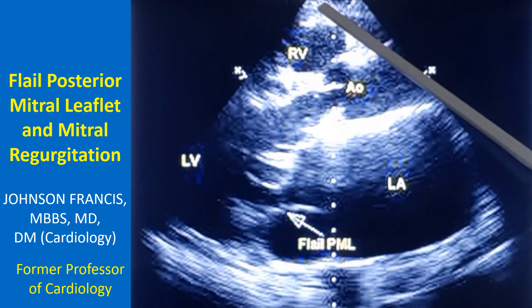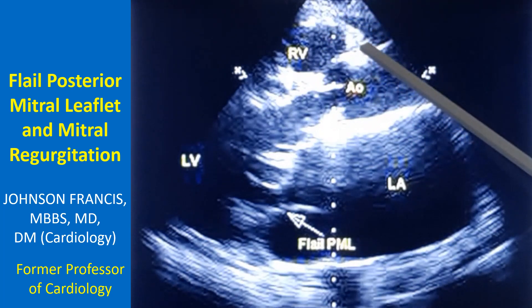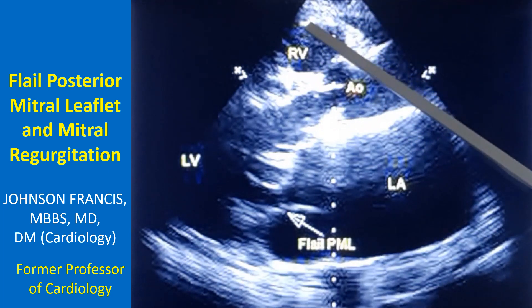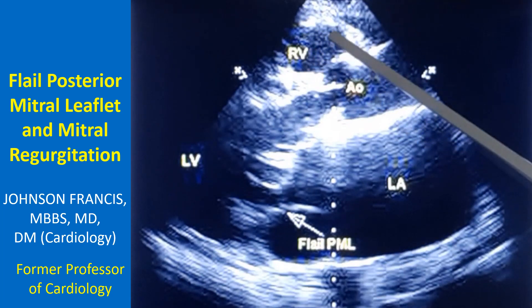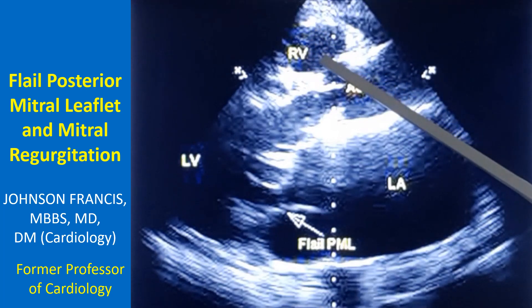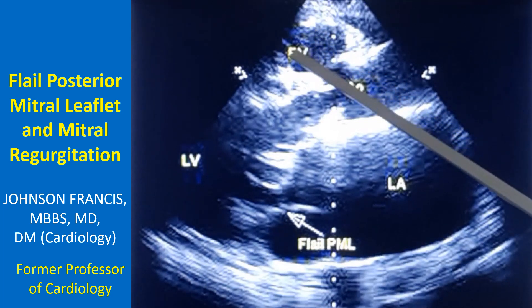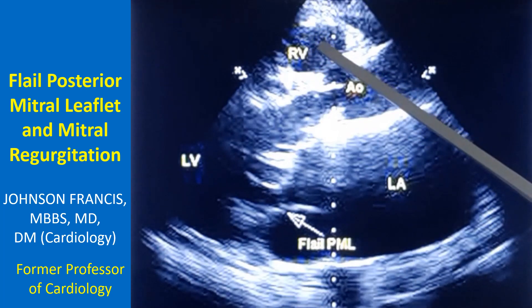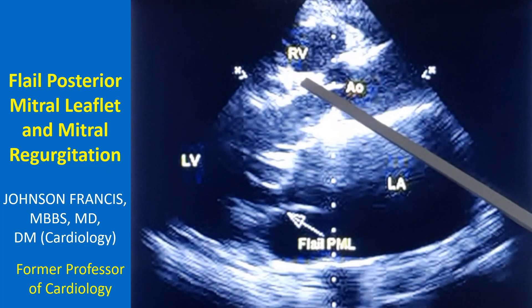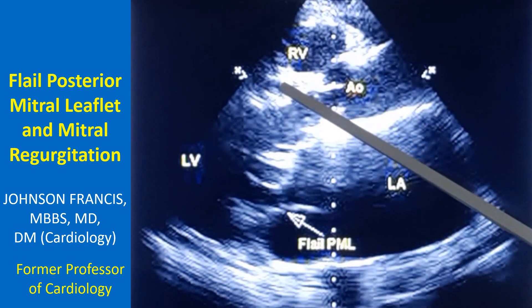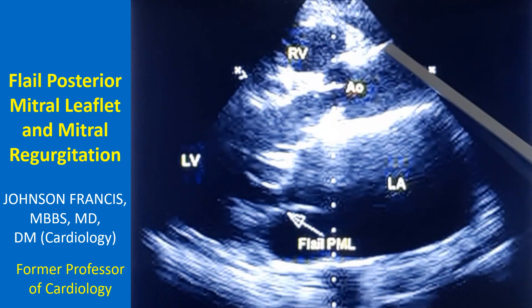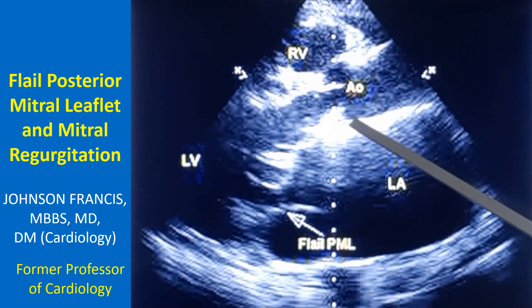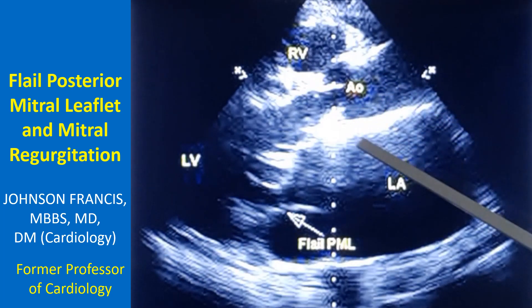Here this represents the anterior chest wall. You can see the anterior wall of the right ventricle and a portion of the right ventricle. This is the outflow region of the right ventricle. Below that is the interventricular septum. This is the anterior wall of the aorta and the posterior wall of the aorta.